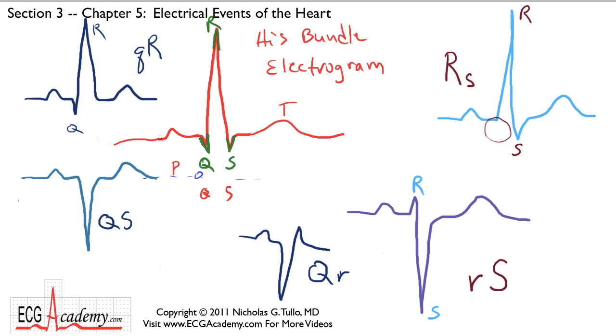Well, there are a couple of other parts that I didn't talk about. First of all, this flat part that follows the P wave is sometimes known as the PR segment. And we can actually measure the PR interval, which is the time interval from the beginning of the P wave to the beginning of the QRS complex. So we'll measure this in subsequent lessons as the PR interval. Okay? Now there's a Q wave, an R and an S. We can measure the duration of the QRS complex. This point right here, where the QRS ends, is known as the J point.